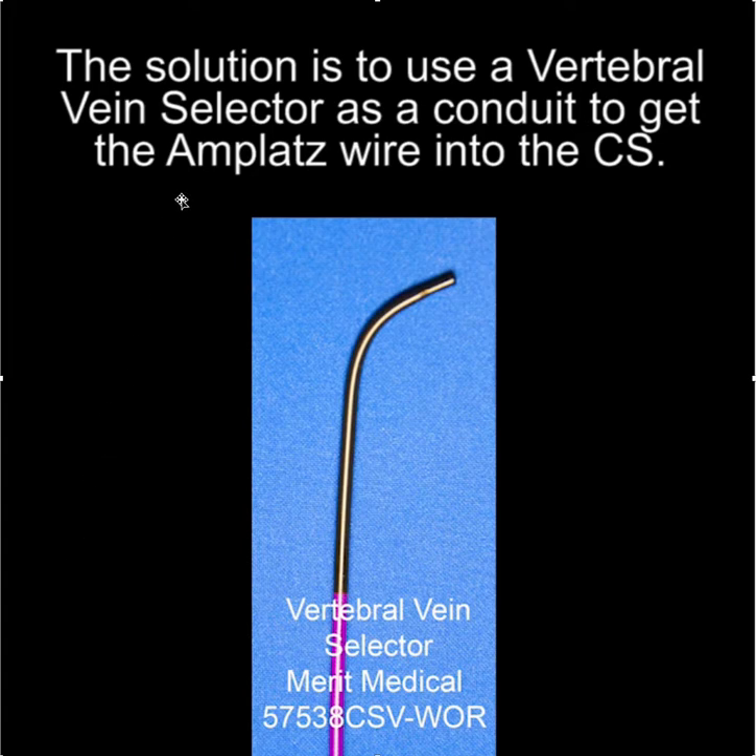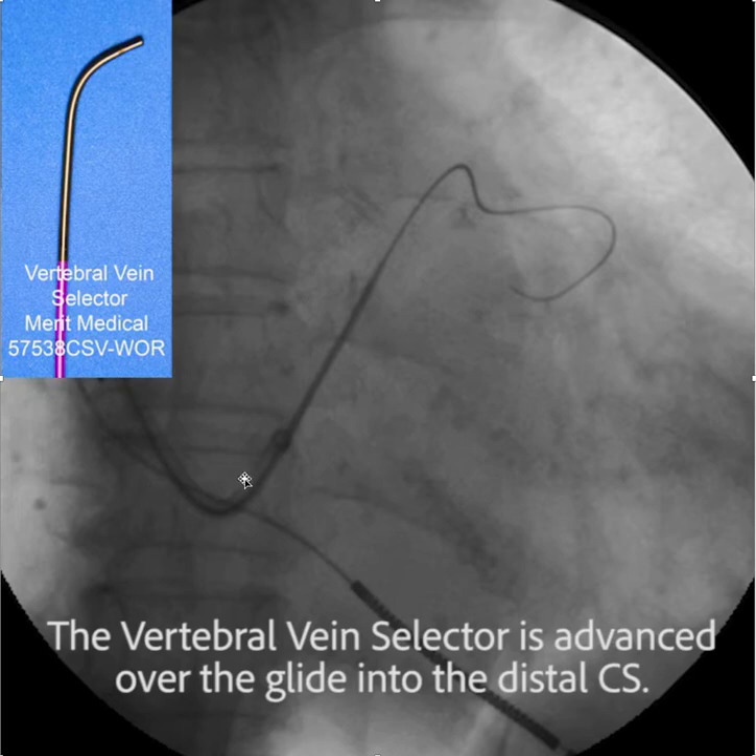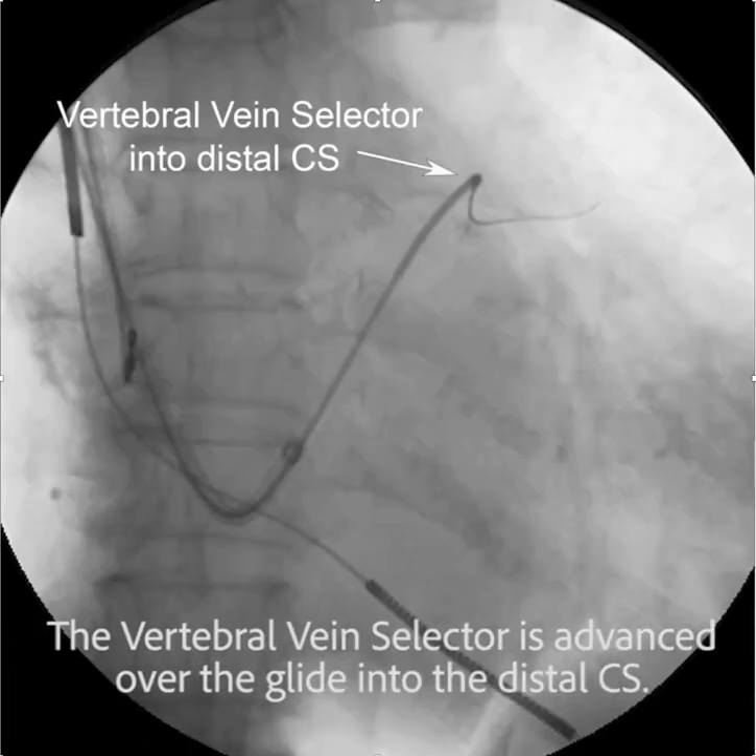So what do you do? The solution is to use a vertebral vein selector as a conduit to get the Amplatz wire into the coronary sinus, or some other catheter. First, the angled glide wire is advanced into the anterior interventricular vein, so deep into the coronary sinus. From there, we'll advance the vertebral vein selector over the glide wire deep into the coronary sinus.